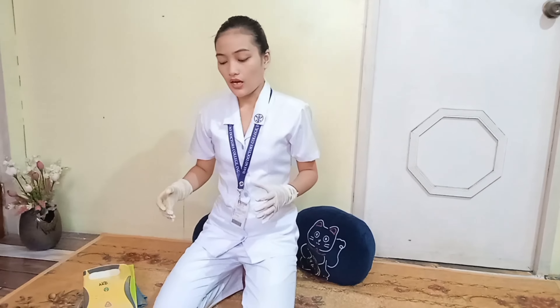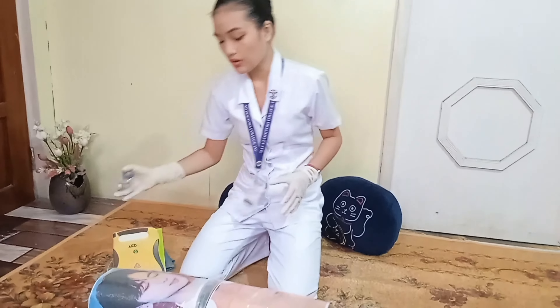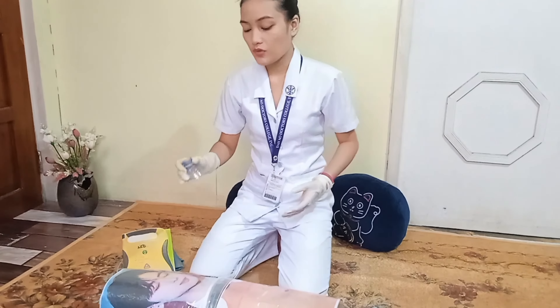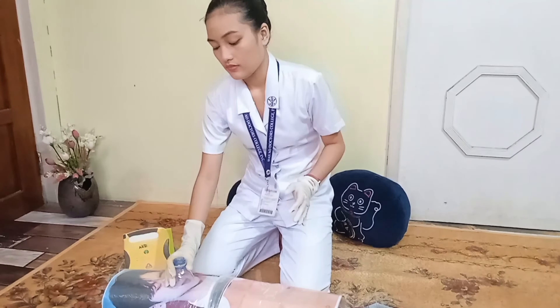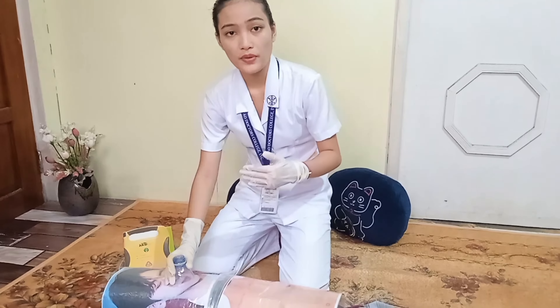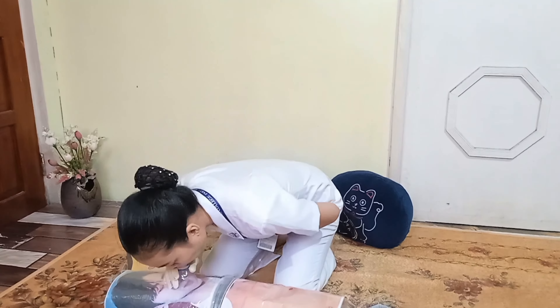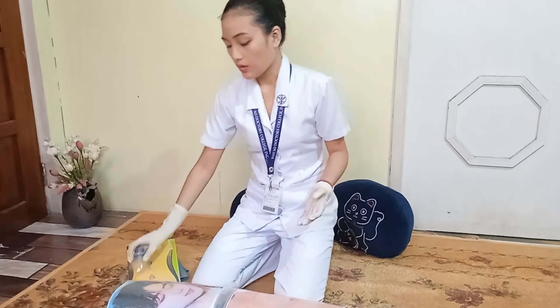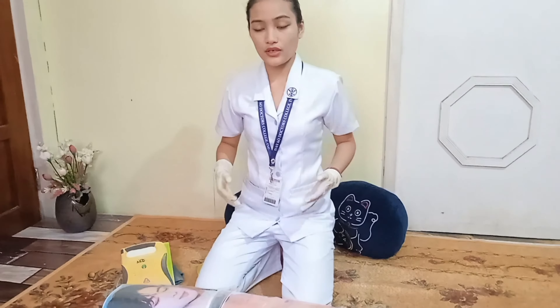After doing the chest compressions, immediately administer two rescue breaths to the patient. I am going to get my bag mask or barrier device, cover the patient's mouth and nose with it, perform a head tilt and chin lift to open the patient's airway, and then deliver the rescue breaths. Each rescue breath should be given over one second and there should be a visible chest rise for each breath.